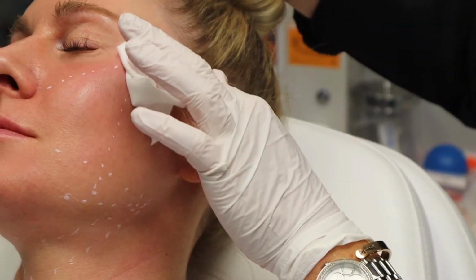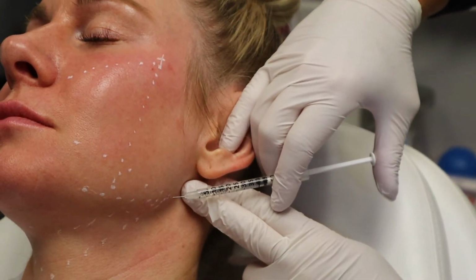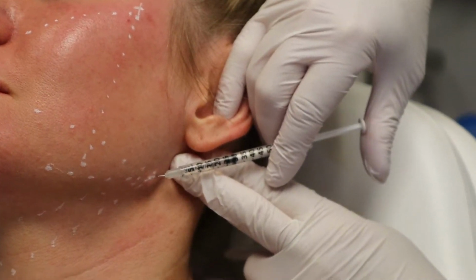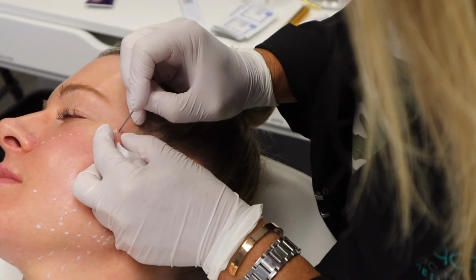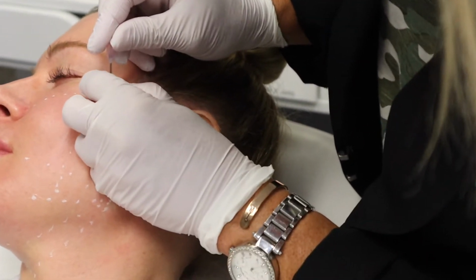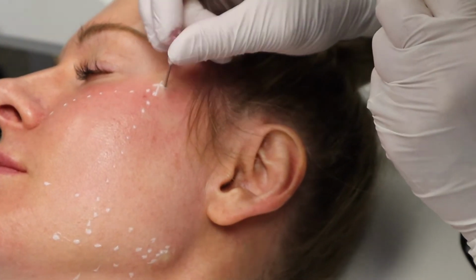The second step of the procedure is to do some local anesthetic in the area where we will be inserting the PDO threads through our cannula. We use a combination of lidocaine with epinephrine in this area, and it is a little bit stingy, but the patient's quite comfortable after, as you can see here, as we are inserting our 18 gauge needle to create an insertion point for the PDO threads that are loaded inside of a cannula.